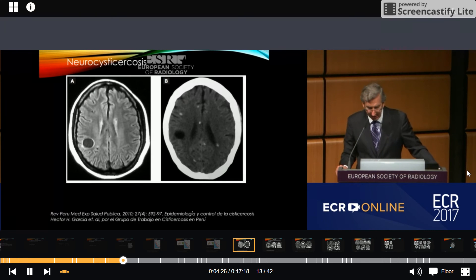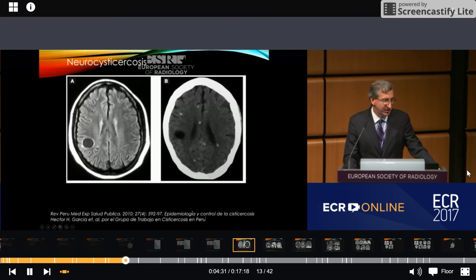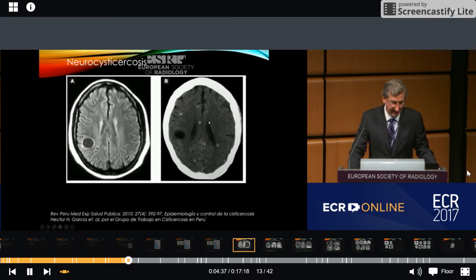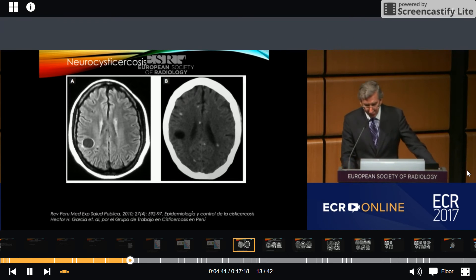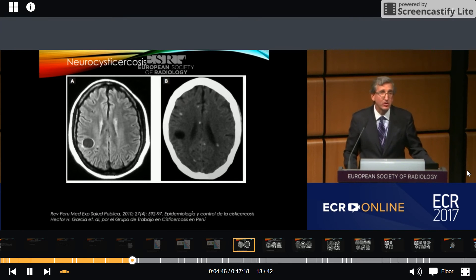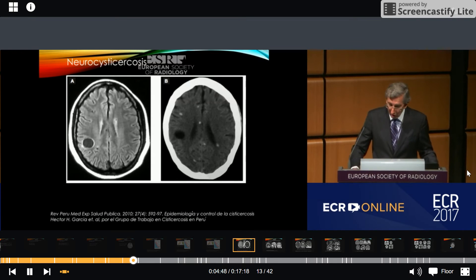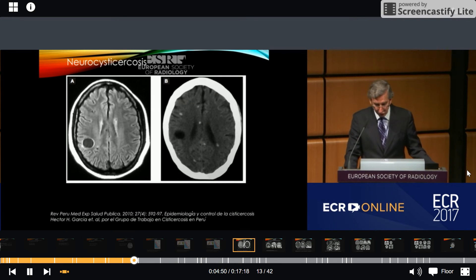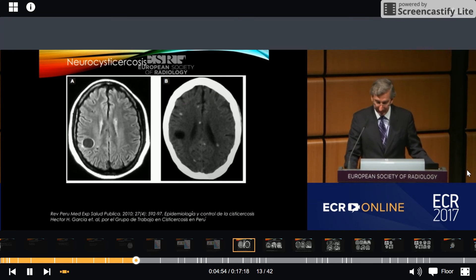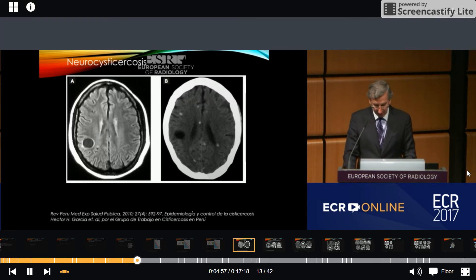Neurocysticercosis is diagnosed by imaging with CT and MRI. As we can see here in this image, the typical cystic appearance is evident, and on CT we can see calcification at the end stage of the disease. The diagnosis is confirmed by serology using the Western blot technique. The Cysticercosis Working Group in Peru was one of the first research groups in the world to apply the immunoblot technique in the epidemiological study of cysticercosis.